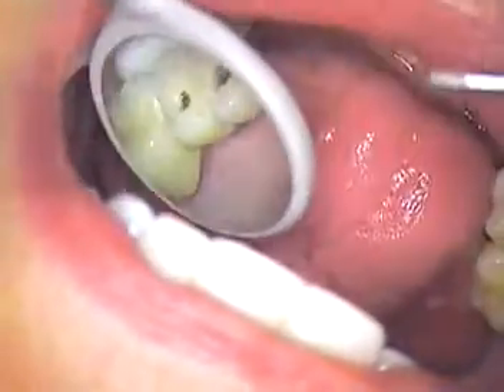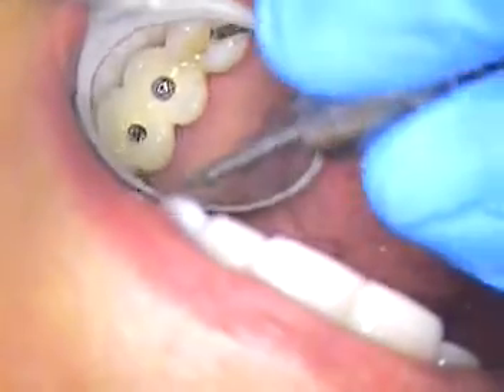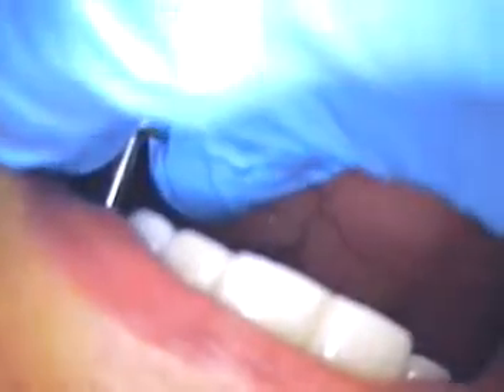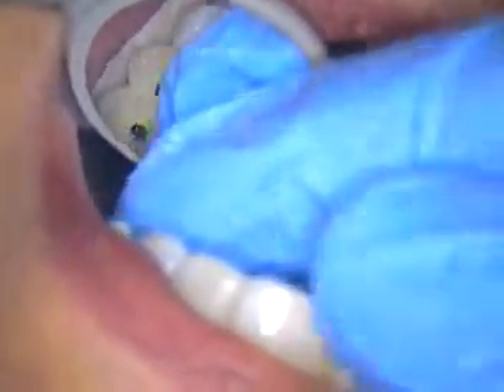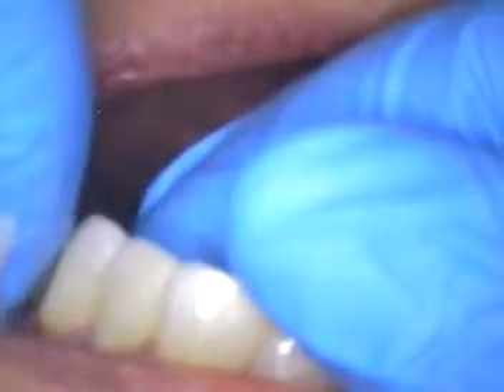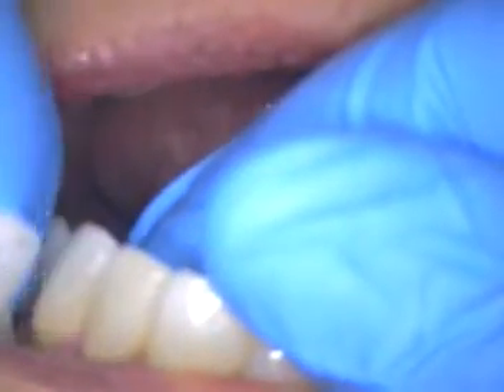Hello, this is Dr. Jerry Cuomo. I'm here finalizing this case for today. What we ended up doing is we got everything out, we were able to put the crowns back in, and now we're hand tightening both the abutment. Instead of cementing over the distal abutment, we're hand tightening the anterior screw. That's pretty tight and pretty solid, it's not moving, and there was absolutely no resistance to the screws going in, so we knew that we were able to clean the situation pretty well.